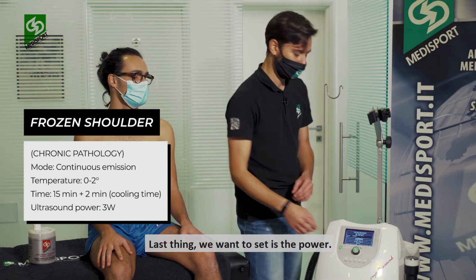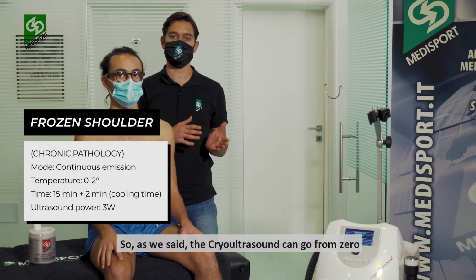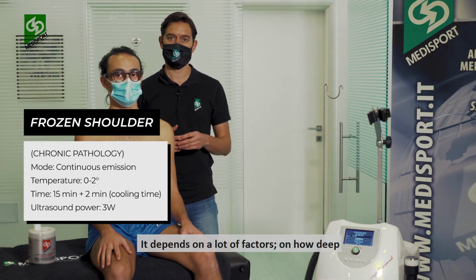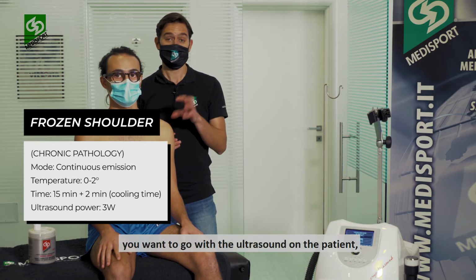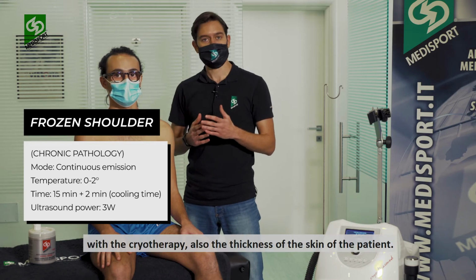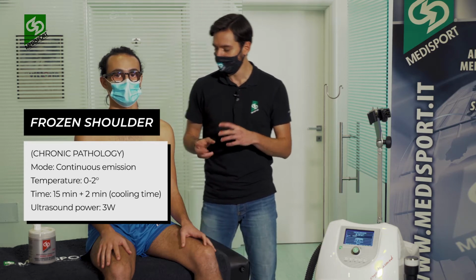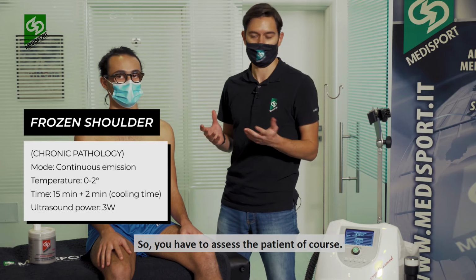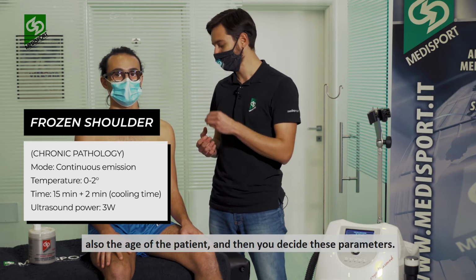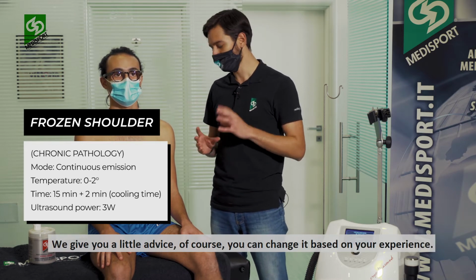Last thing we want to set is the power. As we said, the ultrasound can go from 0 to 3 watts per centimeter square. It depends on a lot of factors: how deep you want to go with the ultrasound, the patient, and with the cryotherapy also, the thickness of the skin of the patient. So you have to assess the patient, of course. You have to consider all these parameters, also the age of the patient, and then you decide these parameters. We give you a little advice. Of course, you can change it based on your experience.